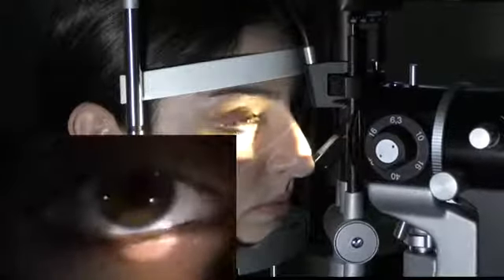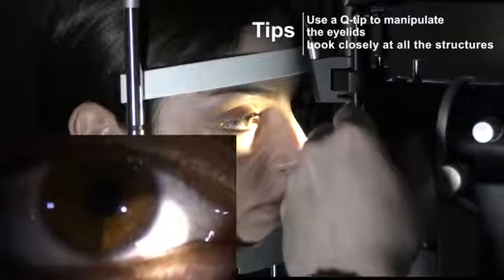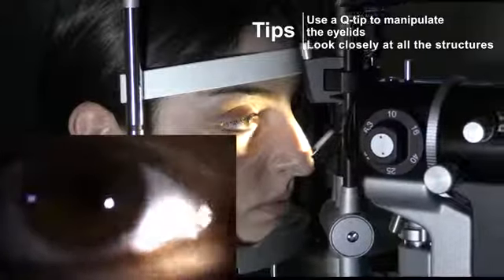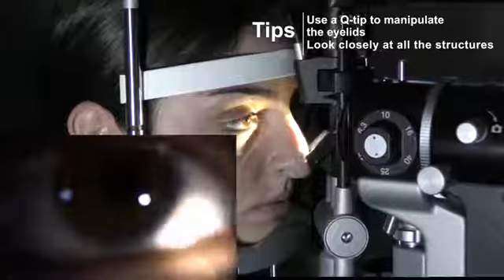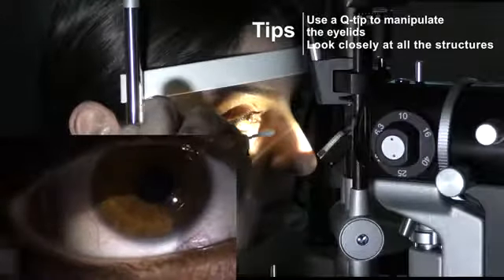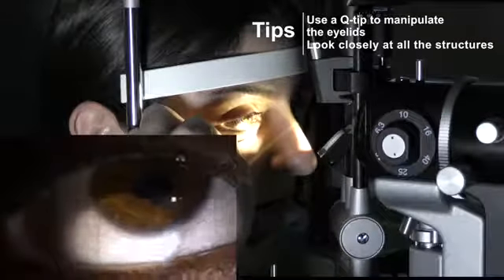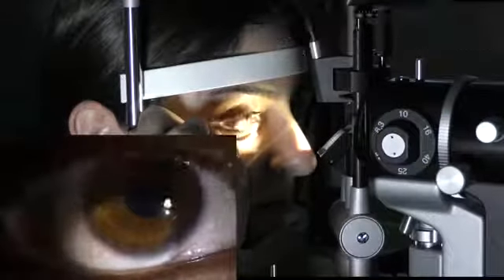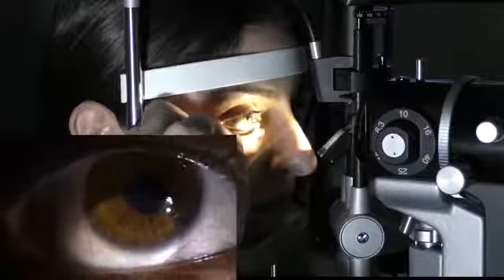And then you can slowly move upwards and take a look at the lid margin. I can zoom in here, increase the magnification to basically look at the lid margin, okay? So now we get into focus here. And we can look at the different structures of the lid, okay? So what I like to do, I like to use a Q-tip. It tends to work well, okay? And I have the patient look straight ahead. So with your other eye, please look at my ear, okay? That way you know that they're looking straight ahead, right at my ear.